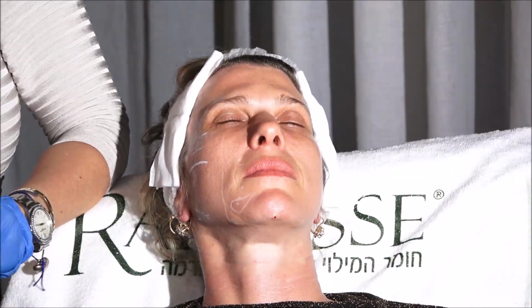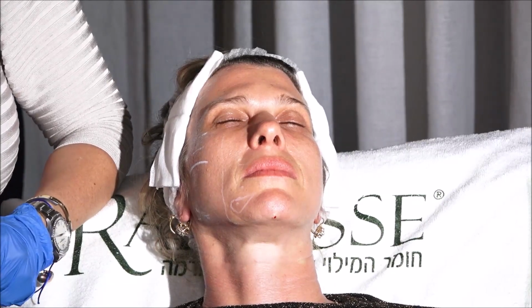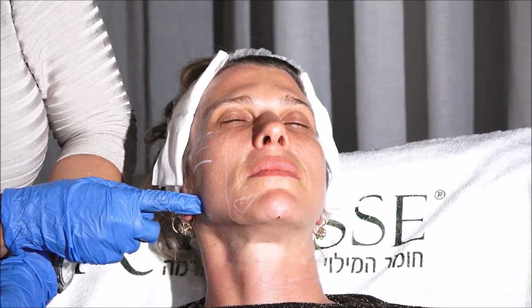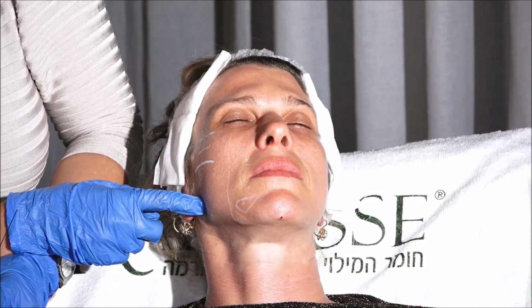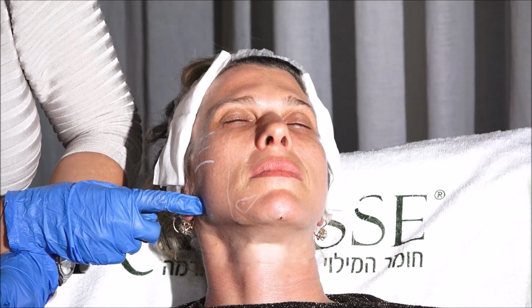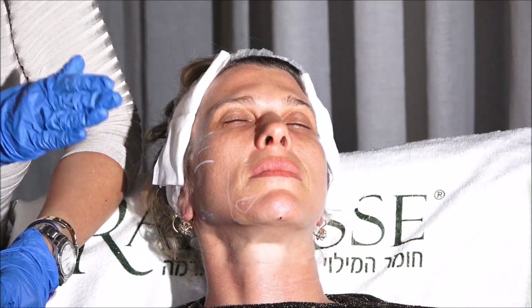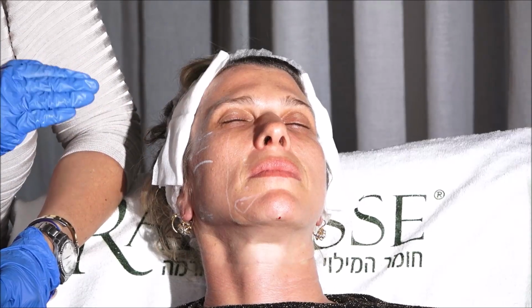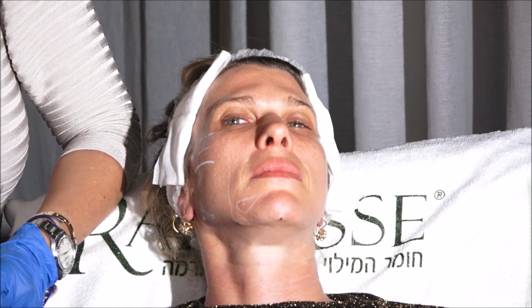Why do I choose this point of entrance? Why don't I inject directly? First of all, if I go directly on the bone, I'm injecting in the muscle. I don't want any product inside muscles. Muscles are not made to have products inside. That's how I think. I respect the function. So I want to be supra-fascia. I spend less product, and I give the sharpness and the structure I want.